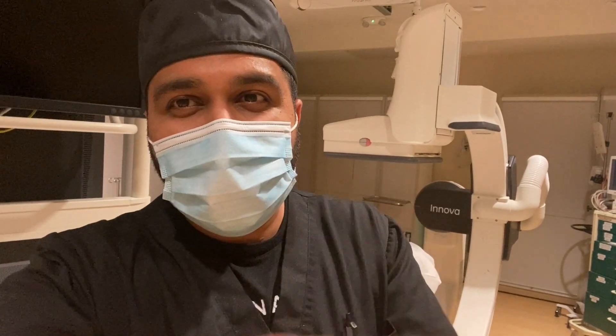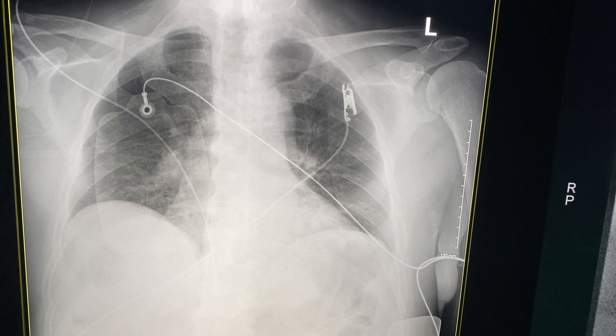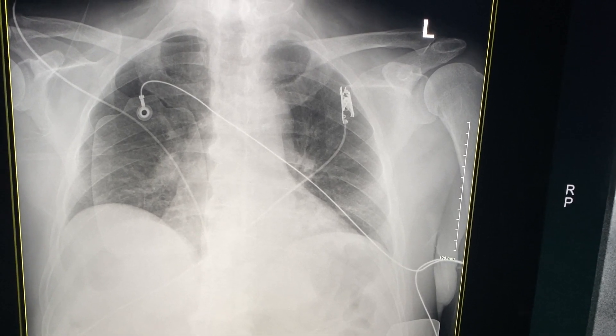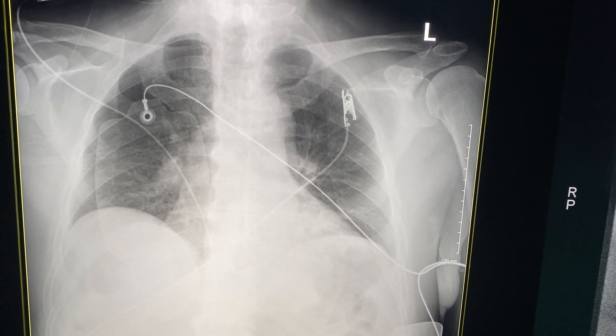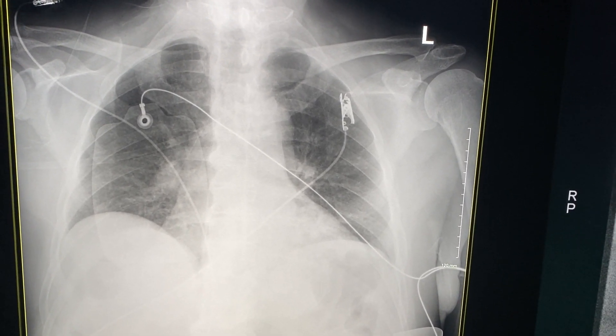What's up guys, let's take a brief look to see what it's like to save somebody's life in interventional radiology. Let's take a quick glimpse into the world of interventional radiology with an actual case.